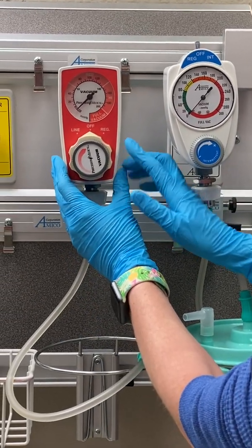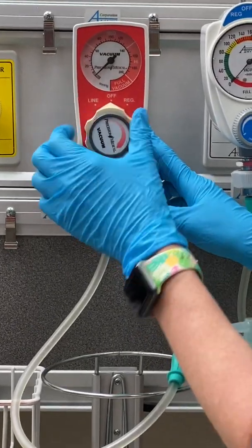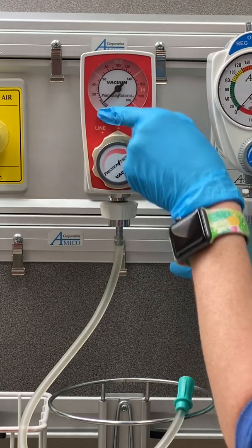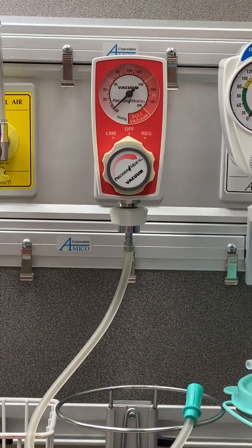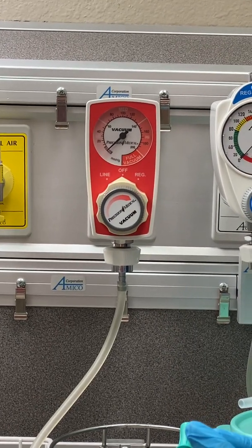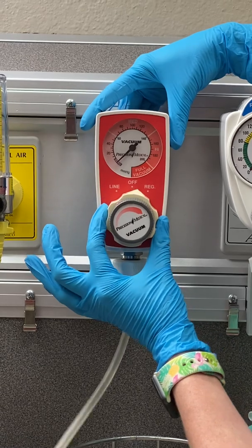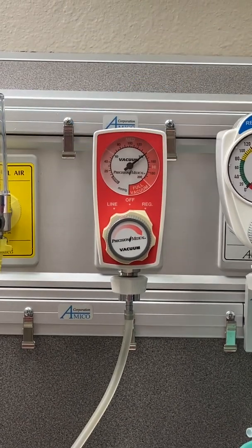We'll start with this one here. So you have REG, line, and off, and then you've got this dial. You can spin this dial and nothing happens until you turn it on. Take note of the pressure inside the regulator — you've got your pressure dial. Oftentimes you'll see orders to set suction to low intermittent, low continuous, or 120 millimeters of mercury — that's what MMHG stands for. So REG means it's going to provide adjustable continuous vacuum suction.